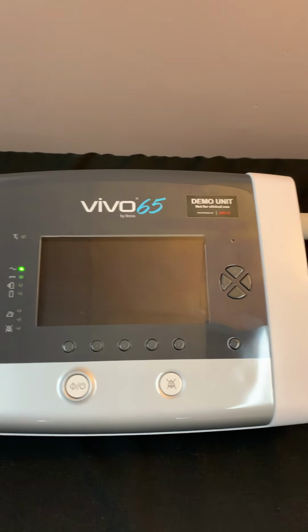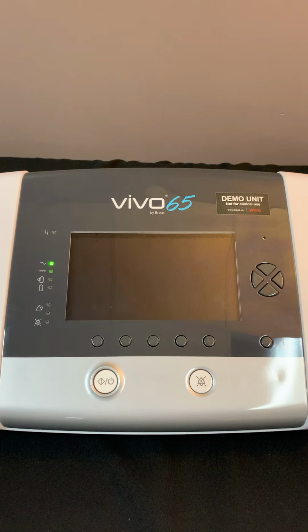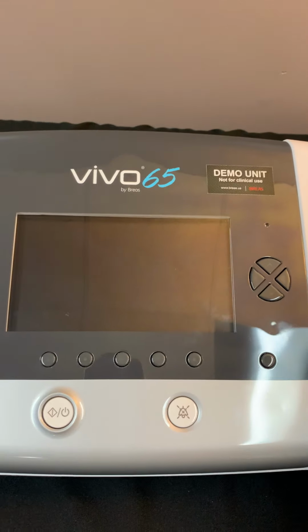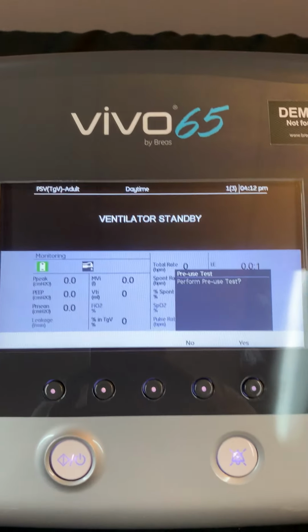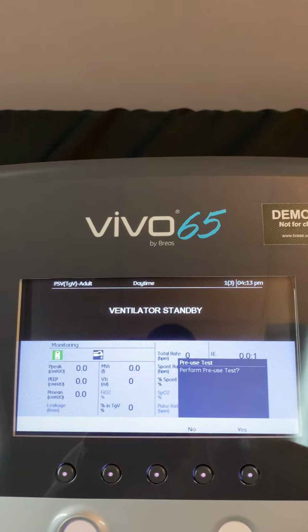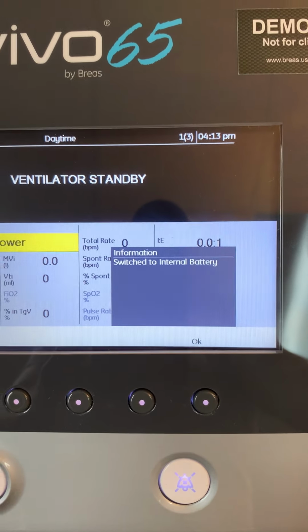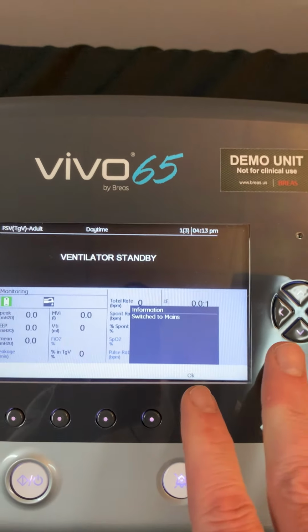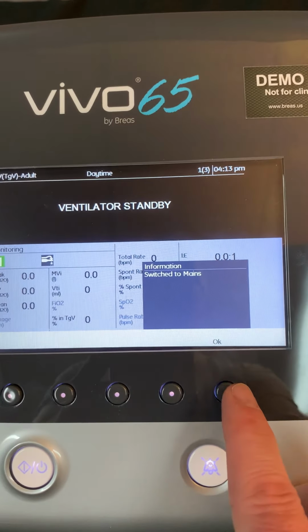I am the Director of Clinical Services for Breas, and over the next few minutes I'm going to go over the front panel of the device. First thing I'm going to do is turn the machine on, and you'll see right away that the ventilator is in standby, and there is an information box in the lower right-hand corner of the screen. This information box may say something other than, do you want to perform a pre-use test? It may say that you've switched to an internal battery, or that you are now running on main power, okay? But the bottom line is that if you see an information box in the lower right-hand corner of the screen, that information box must be acknowledged.